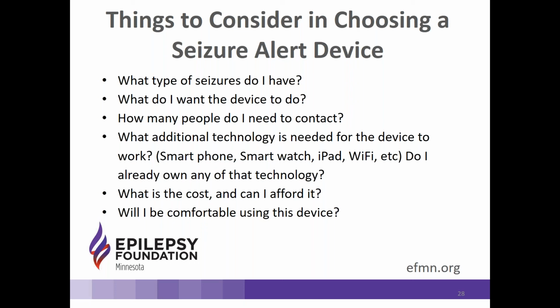When it comes to how they're notified, also, if you're thinking about this happening at night, are they heavy sleepers? I know I, for one, would never hear a text come in at night. So an alarm might be better, that's really loud and really jolts me out of bed. But for other people, they're light sleepers and they might hear the phone call or the text. Or is that going to wake up everybody else in the house, including your other kids? Do they live with you?